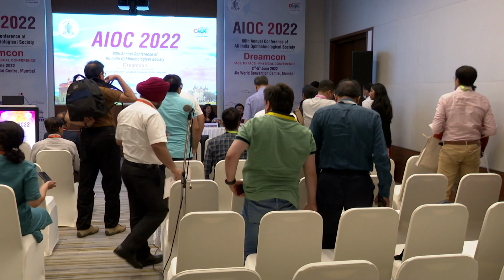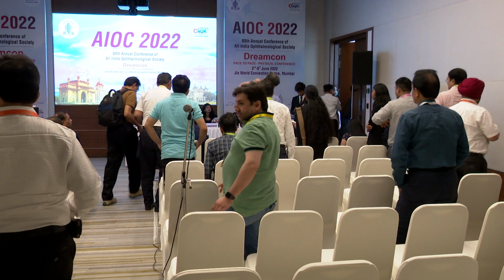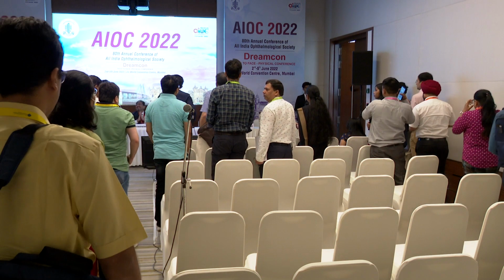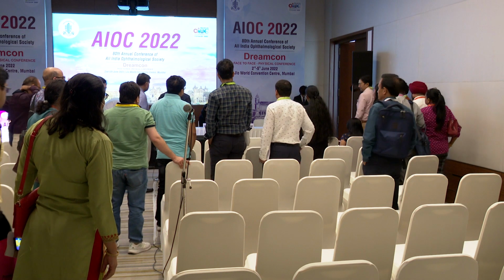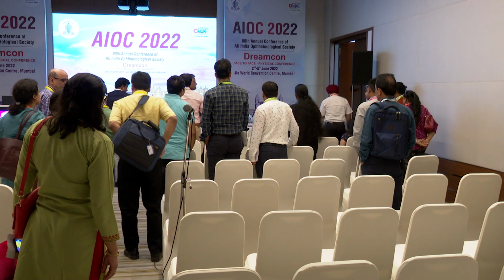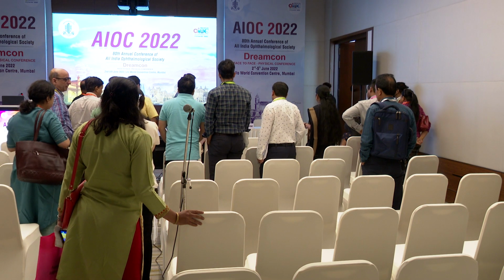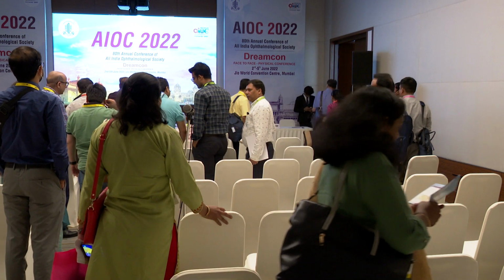Sir, just one doubt. About the integrating indicators which you mentioned, how many to place in a bin and where should we place them? It should be placed one in every run of the autoclave at the remotest corner. There is something called a towel challenge. So you wrap it in multiple towels and put it at the remotest corner. That is if in a bin we have lots of sets, no, one outside the bin. This will be taken as a separate area. In the bin, process indicators can be made separately only. This is not inside, so no problem. Yes, they can do that.